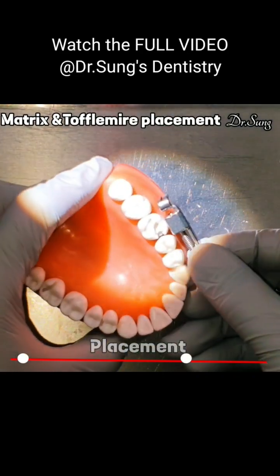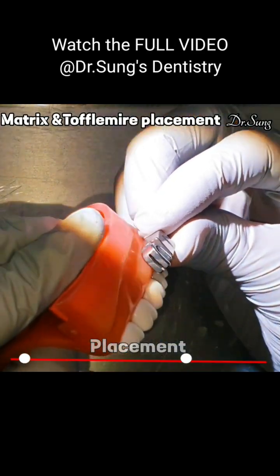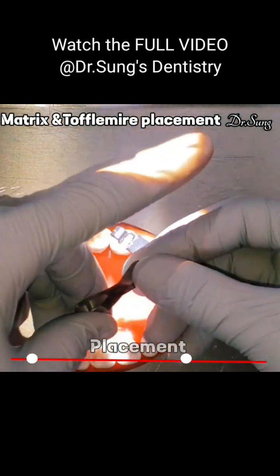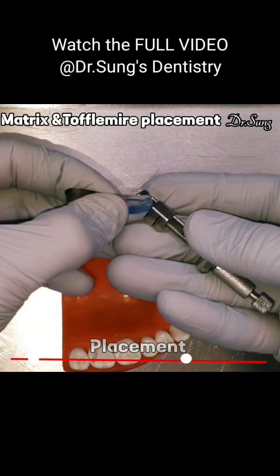We always want to take it out occlusally, because we cannot take it out gingivally — we would be damaging the gingiva, and it is very uncomfortable. So since this one is occlusal, this occlusal surface needs to go on the occlusal. So occlusal to occlusal.